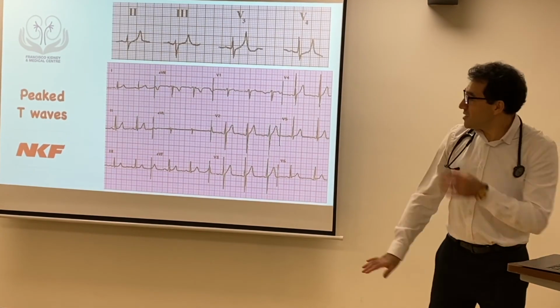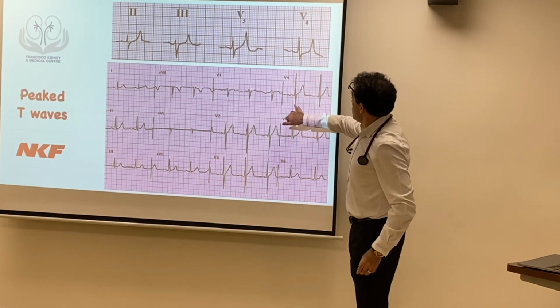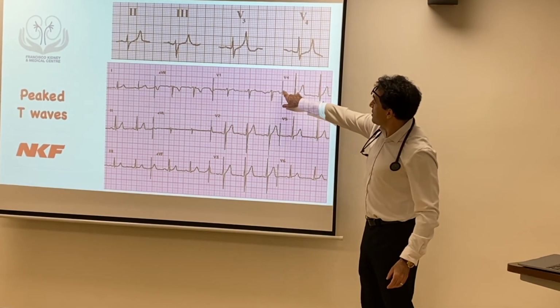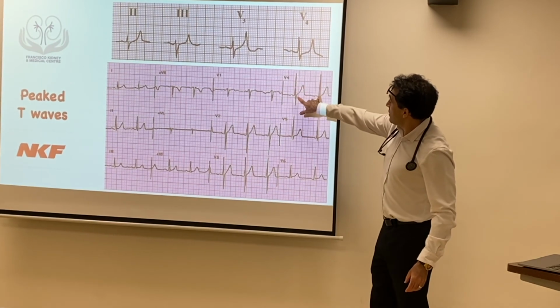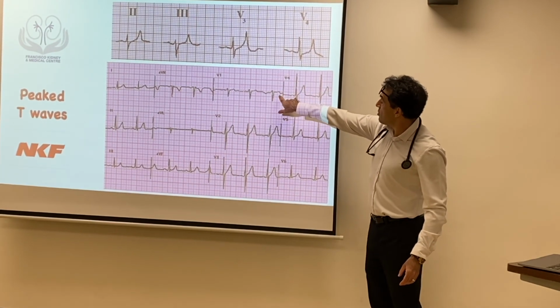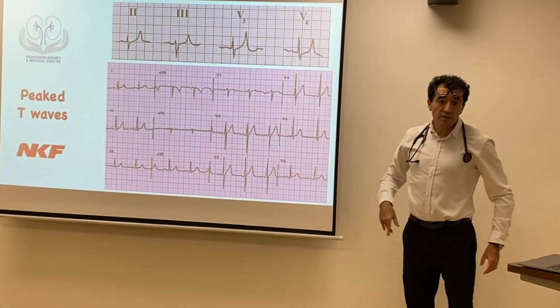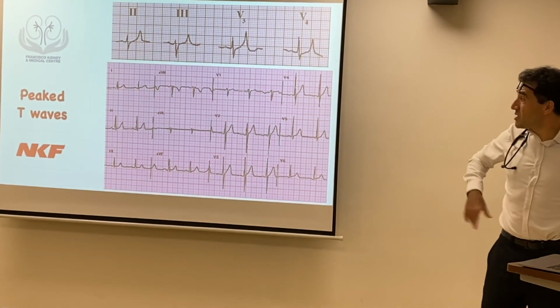Okay, I'll just tell you. In the other one, you will see that probably there is no P wave, and typically it's irregular. For example, this will be one QRS complex, another one, and there is no P wave. Sometimes there's fluctuation, but it looks a little bit different.